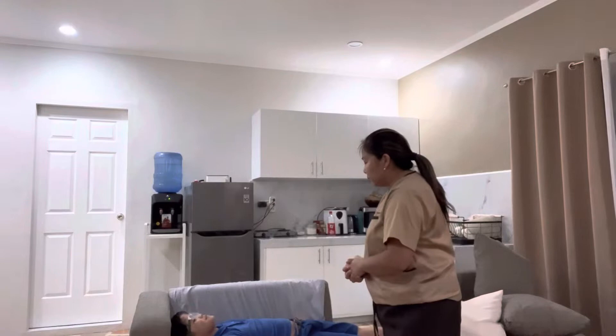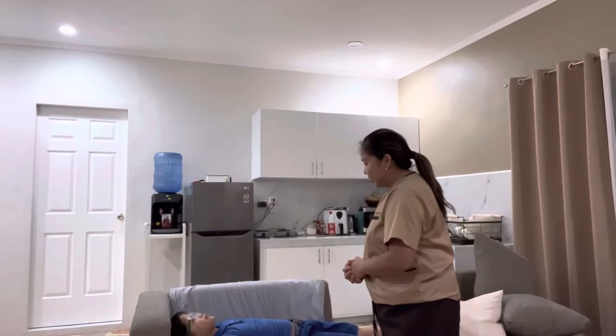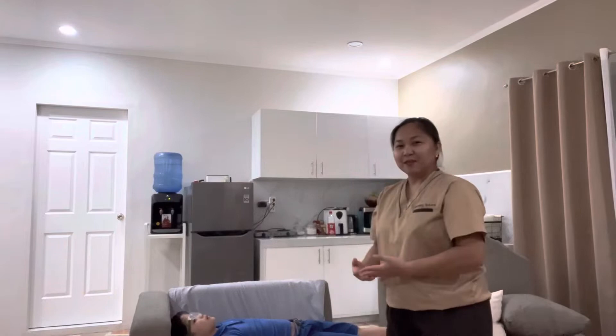Hi sir, my name is Nurse Jara. What's your full name, please? Thank you. And what's your date of birth? Thank you so much. I have now identified those identifiers from my patient, and I'm going to provide some privacy before doing this procedure.